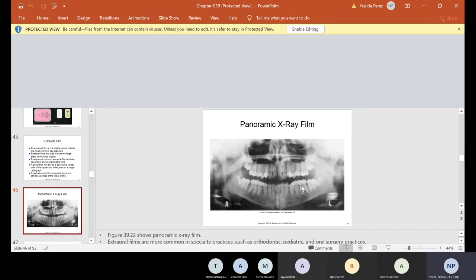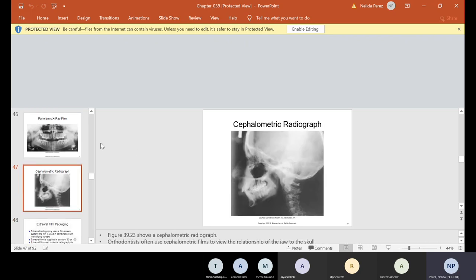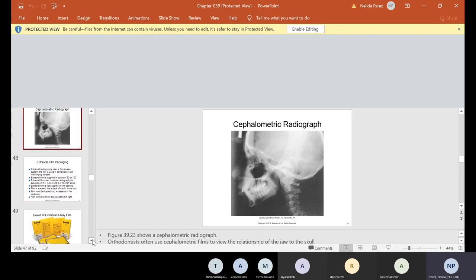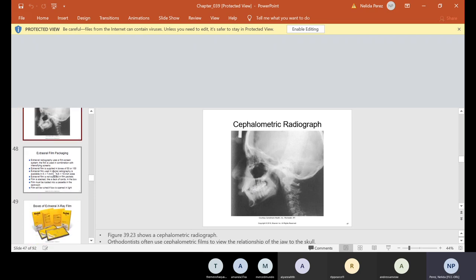On the panoramic, we can count how many teeth are in the patient's mouth. We always start from the upper right, go across, then drop down and come back to the lower right. The panoramic film can tell you things like impacted teeth, missing teeth, breaks in the jaw, and sinuses. The cephalometric is used a lot to view the relationship of the jaw to the skull. Ortho uses this a lot to trace and figure out their treatment plan.